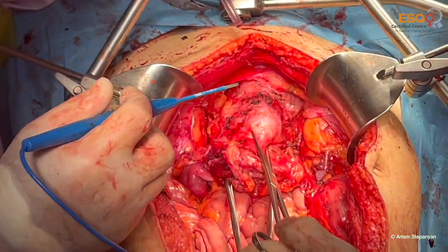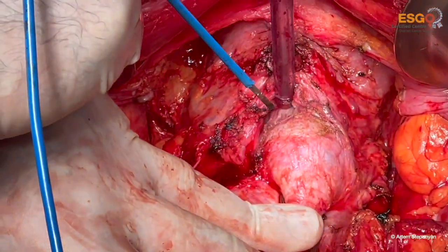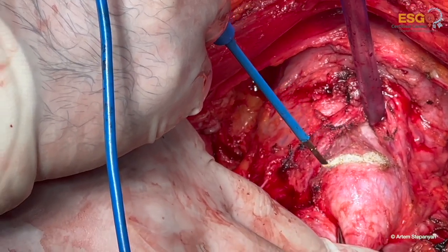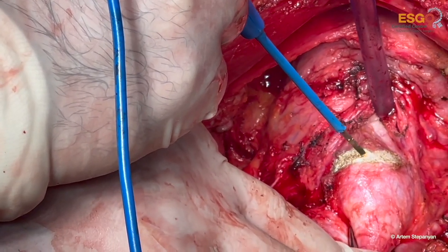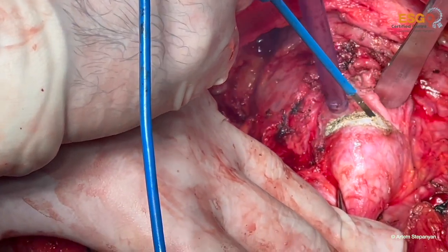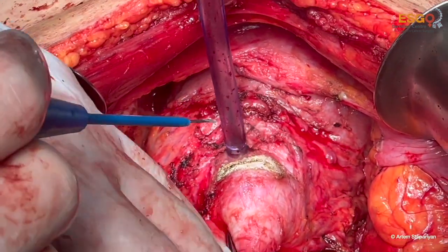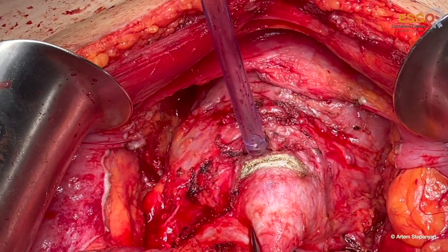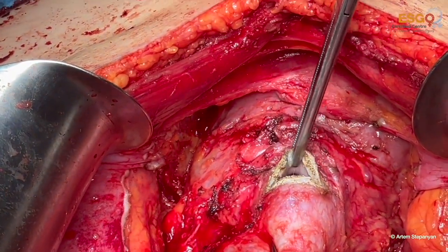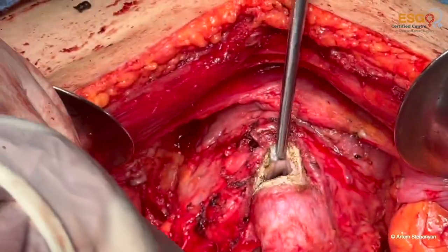I catch the cervix with the bullet forceps, and then I cut the anterior vaginal fornix and enter the vaginal lumen. Yes, I'm in the vaginal lumen. The anterior vaginal wall is grasped by Coker clamp.